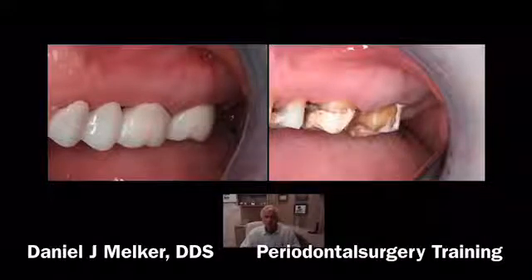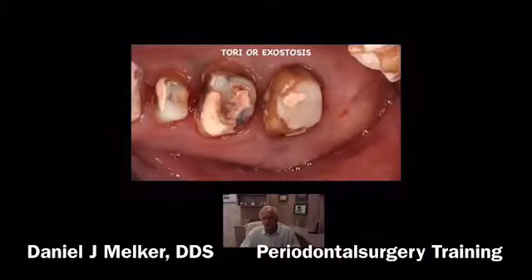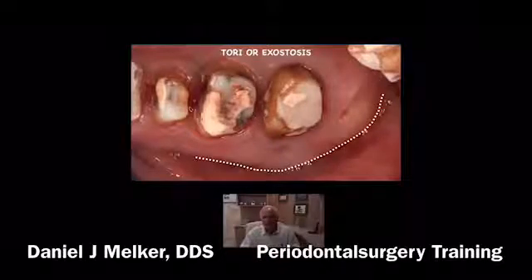I took my finger and felt it, and there's a very large exostosis — huge. You must be very slow and very meticulous when you're laying your flap back. You want to come all the way up here in the middle of the tuberosity. You don't want to be out here — that's where the bone is, and then you would work your way around.